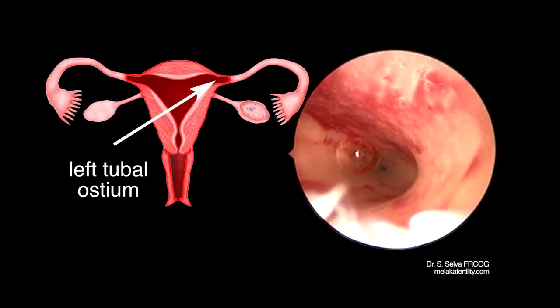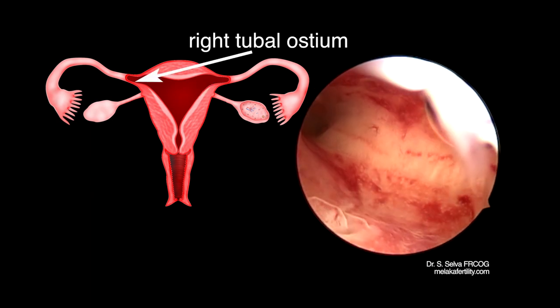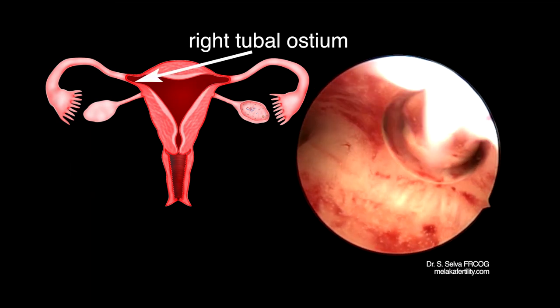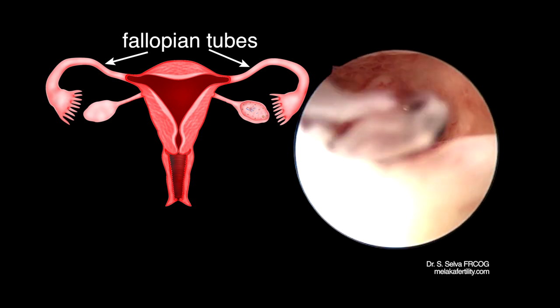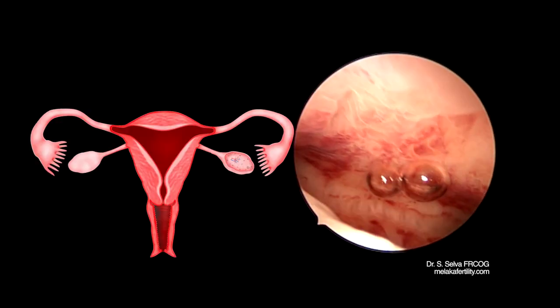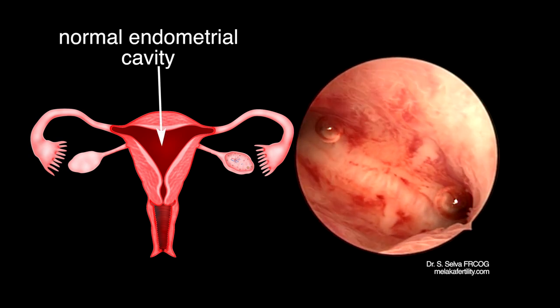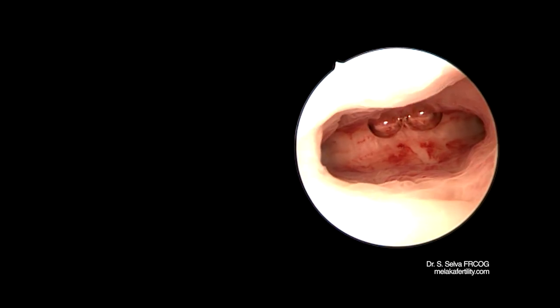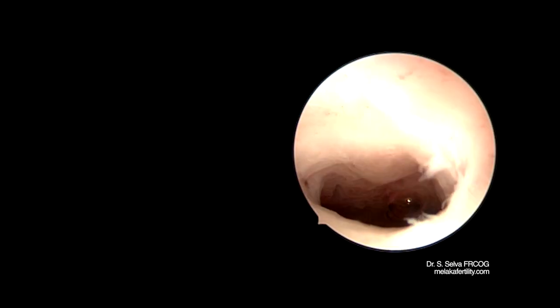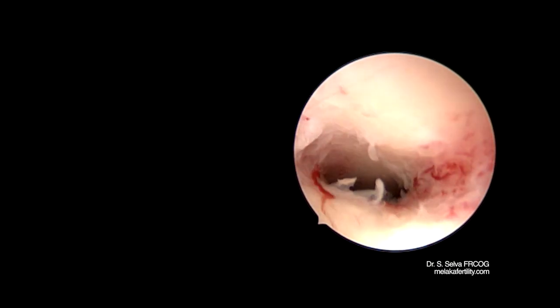This is the left tubal ostium. This is the right tubal ostium. The tubal ostiums lead to the fallopian tubes. This is the normal endometrial cavity. The hysteroscope is then withdrawn from the endometrial cavity and the cervix.